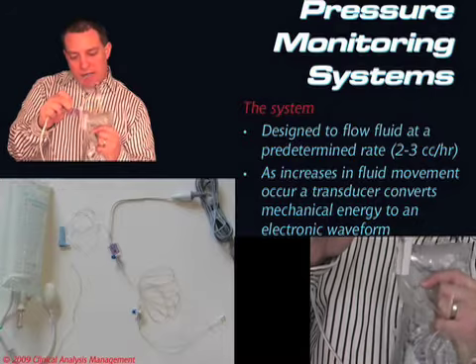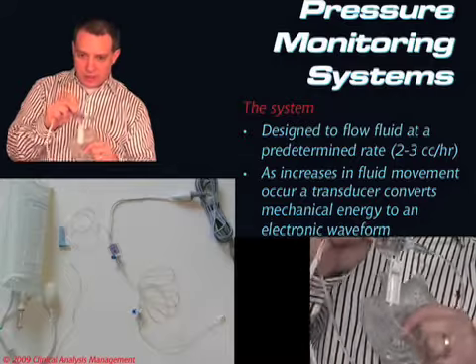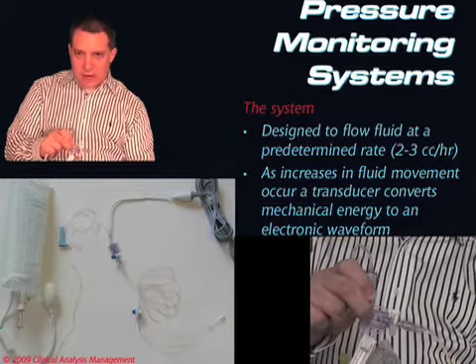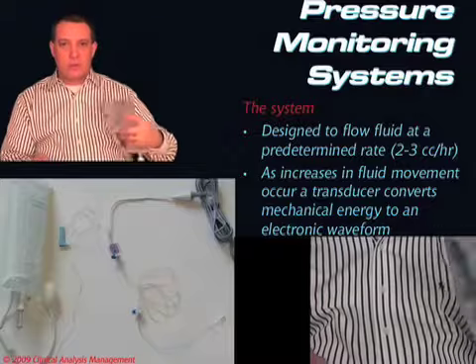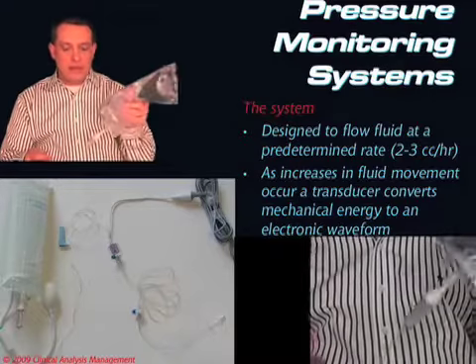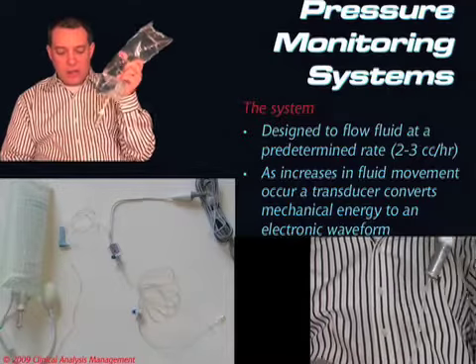Now, I've still got lots of air in the bag, but the advantage is that once we have all the air out of the tubing, we don't have to worry about what we're going to do with this bag. We can take this bag and do whatever with it. We can throw it on the patient's lap. We can hang it. We can drop it on the floor. It doesn't matter, because now we no longer have concern about getting air into this line.